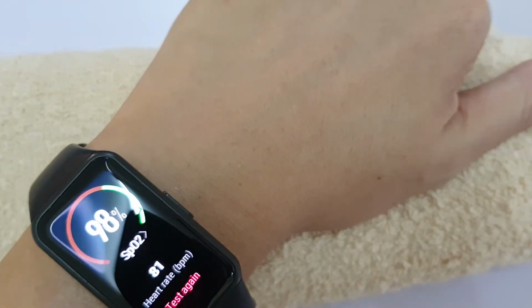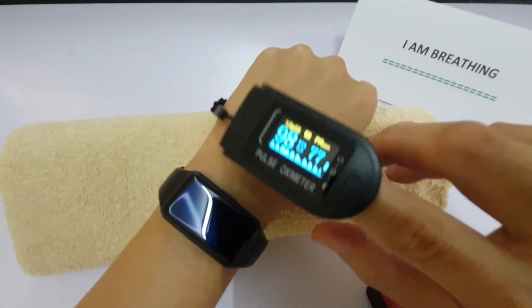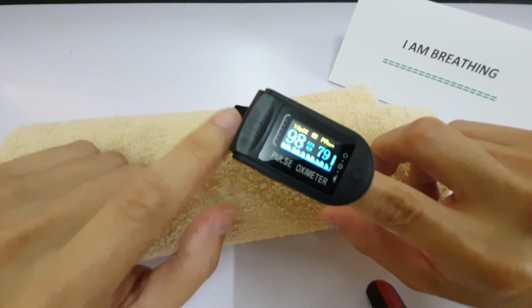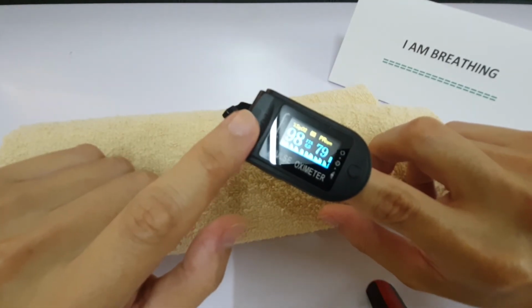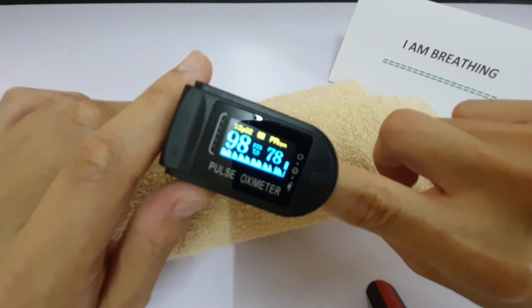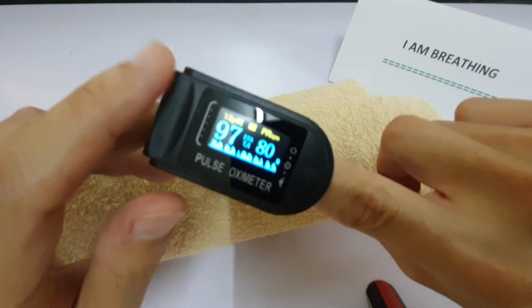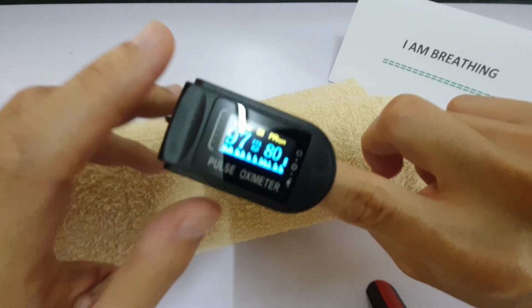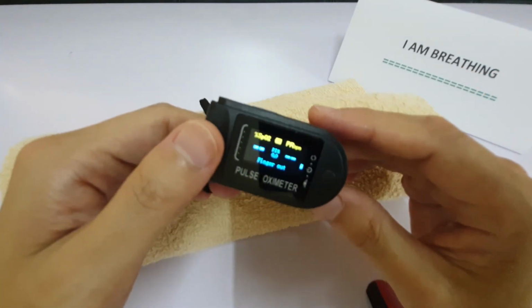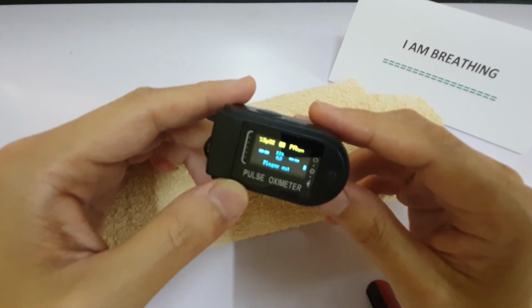So I would say that still, whenever possible, which is only $5 for this particular pulse oximeter, get one for each of your household, because this could be very useful in times when you want to confirm whether someone is breathing properly or not. Again, once you take it out, once it stops detecting the pulse, it will turn off the oximeter.